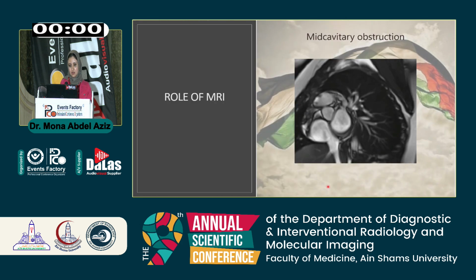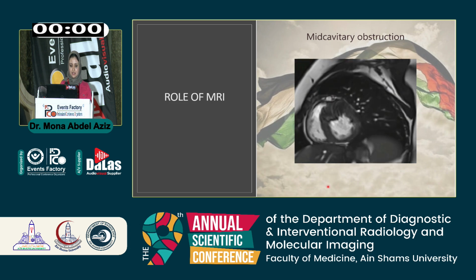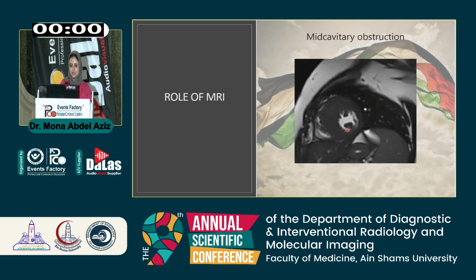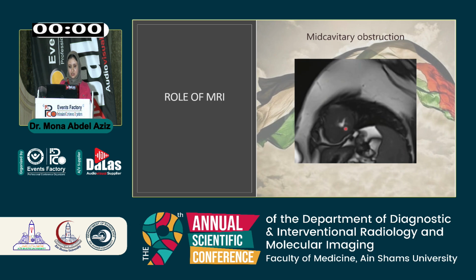And also the assessment of mid-cavitary obstruction in the short axis Cine images. It will appear as near total or total disappearance of the cavity in the mid-cavity during systole.